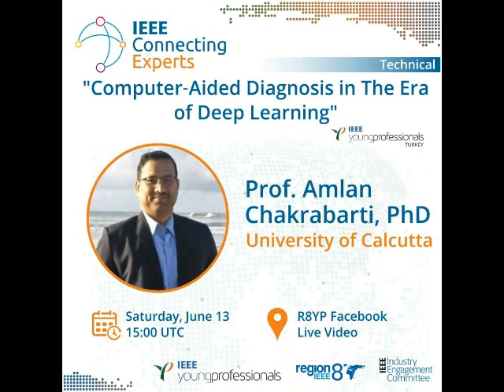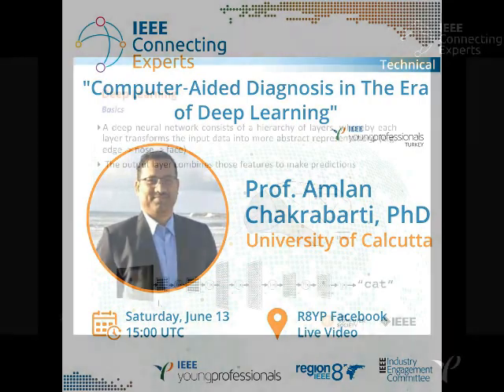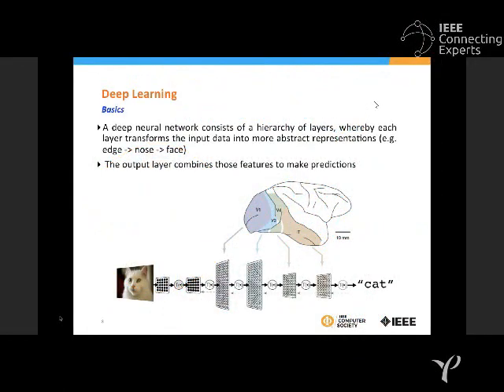So what I was trying to say is something like this: when we try to detect the edge features in the next layer, I try to use the next level of feature extraction, which can work on the detected edges and apply some sort of spatial features or contour features to identify the objects.